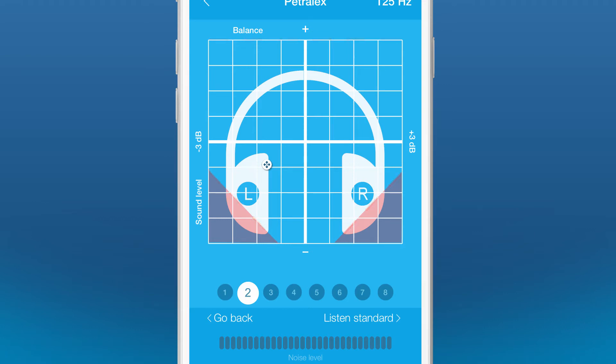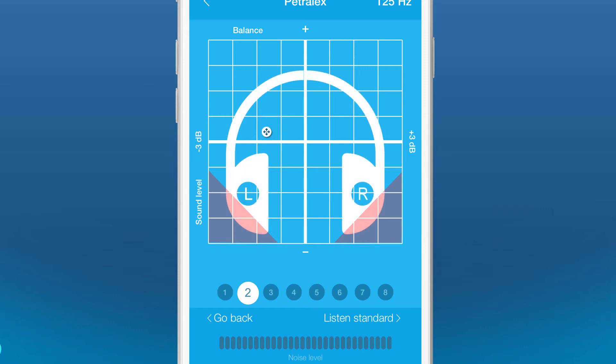Identify the perception balance by the right and left ear at the same time. Subjectively, the sound should be in the center of your head.